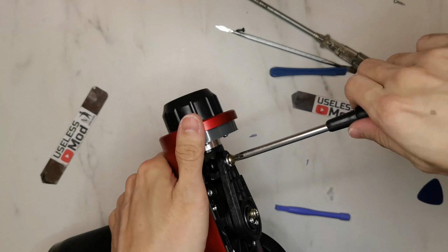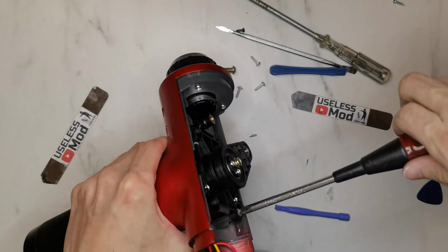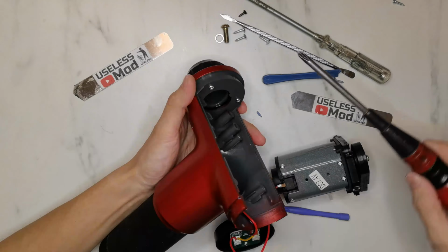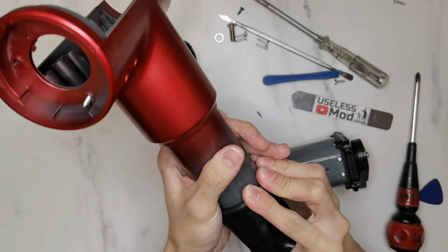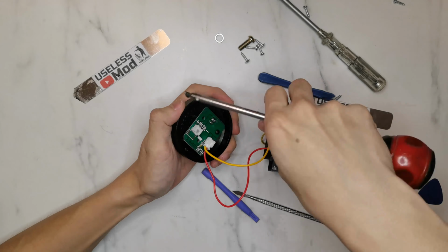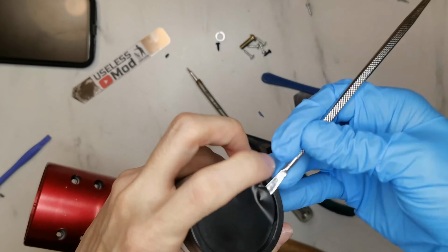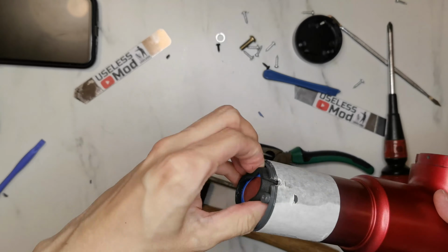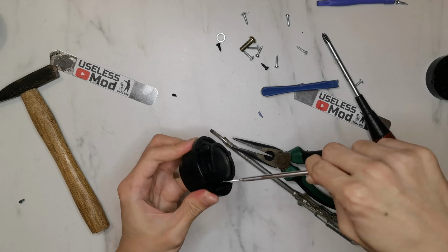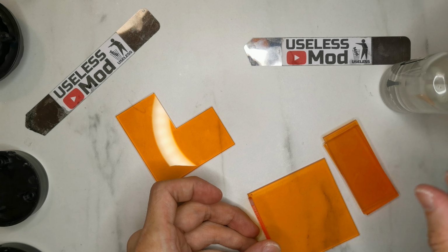Remove the connection screw and 4 screws securing the motor. Take out the motor. Unscrew the front cap. Take away the rubber cover. Unplug the battery and unscrew the control board. Remove the bottom sticker. Untighten the bottom cap screw. Remove the battery. Take away the bushing. Now all the case has been removed.